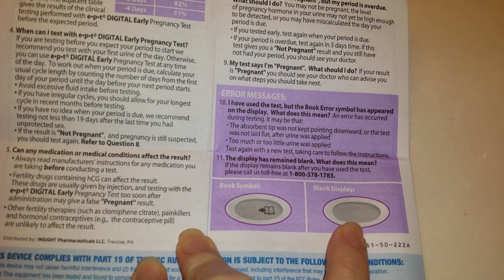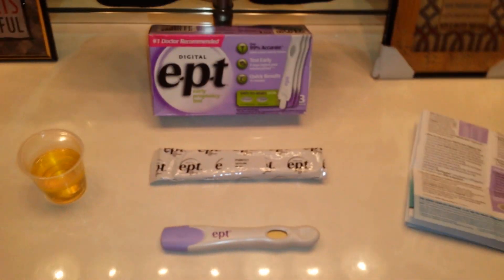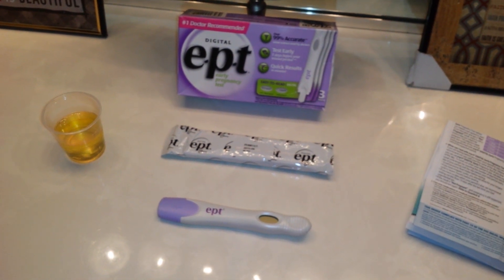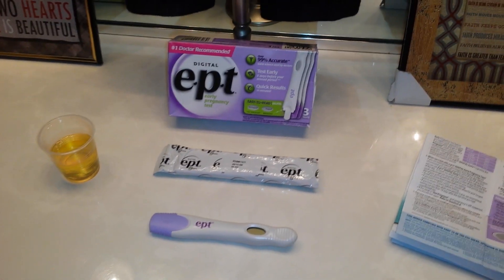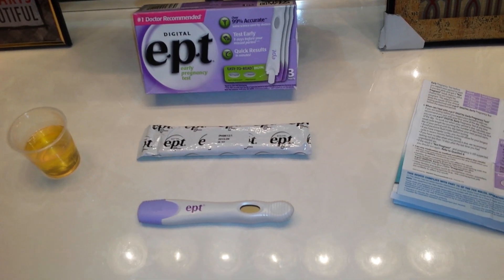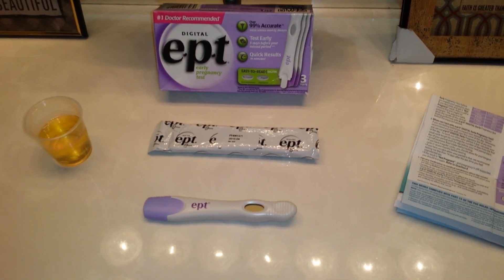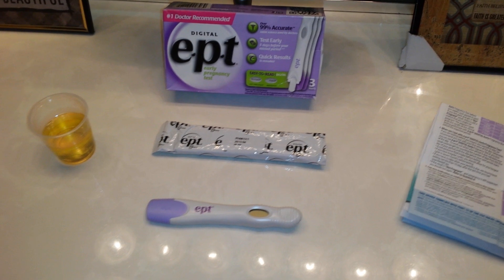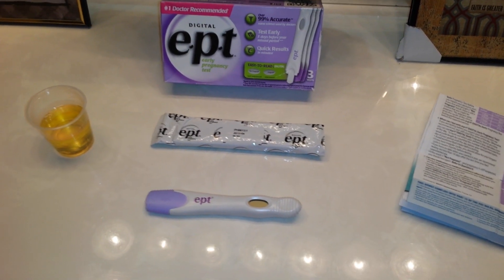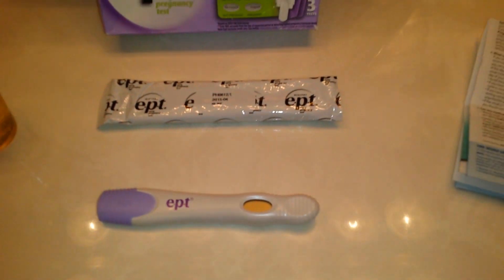If the screen is completely blank, you'd have to call the manufacturer to find out what's going on. One of the reasons it's so important to read the instructions is that with this test specifically, if you don't dip it long enough, or even a couple of seconds too long, or if you don't lay it flat immediately, you can get an error message and ultimately waste a test. So it's really important to dip it for the precise amount of time. I advise against holding it in your urine stream because there's a computer chip inside and you risk splashing the screen, which can also cause an error.